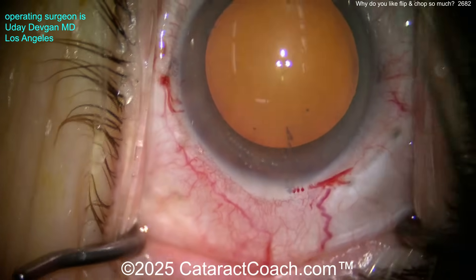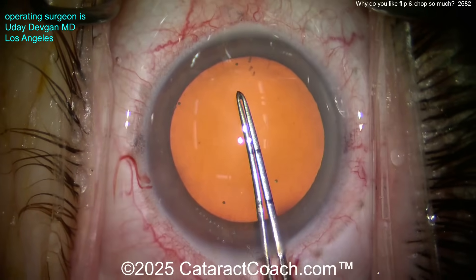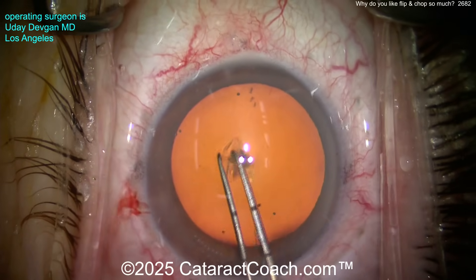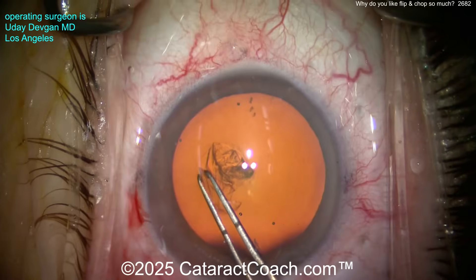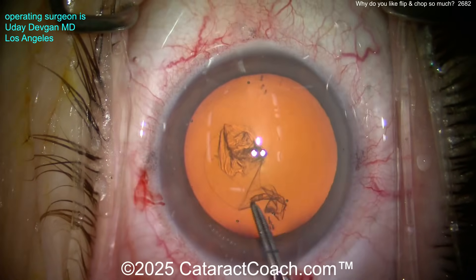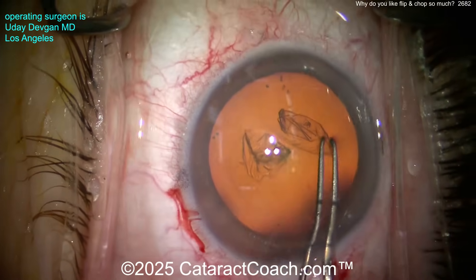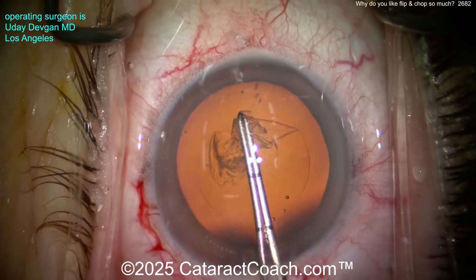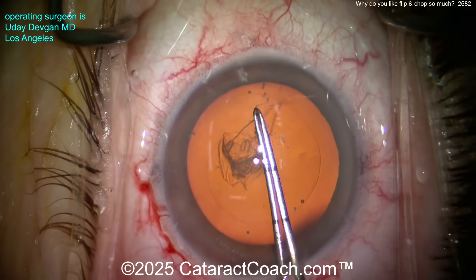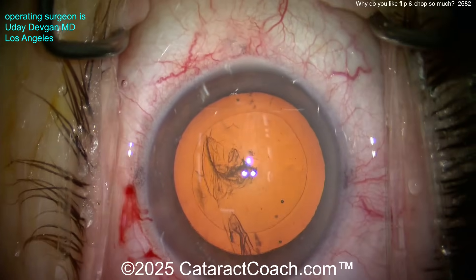Now we'll get our rhexis done. I'm going to use my forceps that are marked off — those marks are two and a half and five millimeters on the tip. So as we make the rhexis, we can create that perfect five to five-and-a-half millimeter capsulorhexis. Starting the rhexis here, going around — showing you the video start to finish. I'm not in a rush. I just want this to be really beautiful. In my patient population, cataracts are across the spectrum. A lot have softer cataracts with just a little nuclear sclerosis, though some patients have very dense cataracts too.